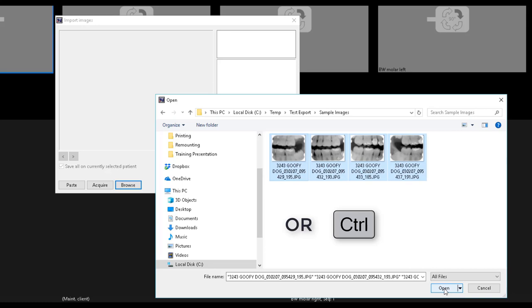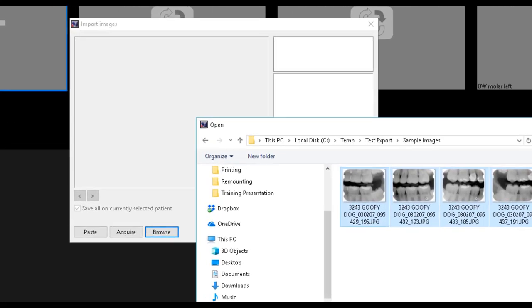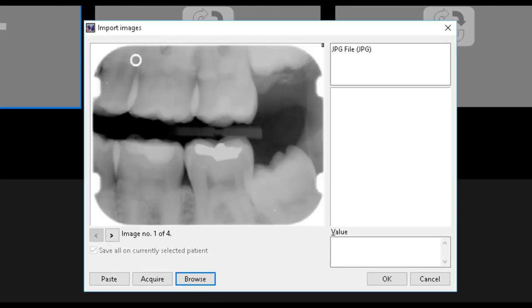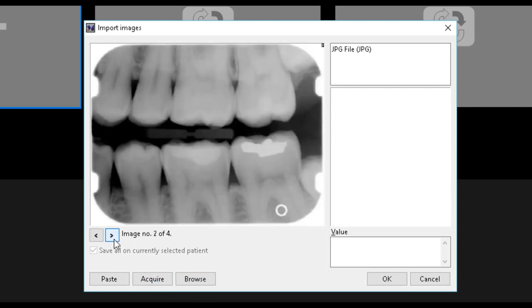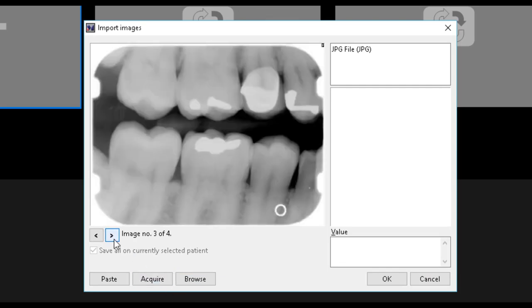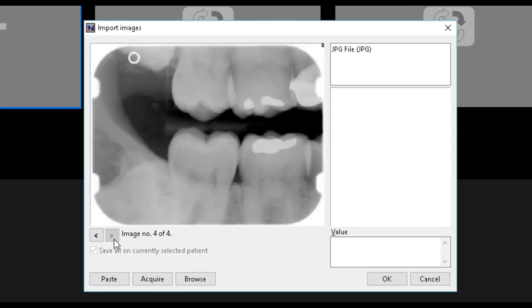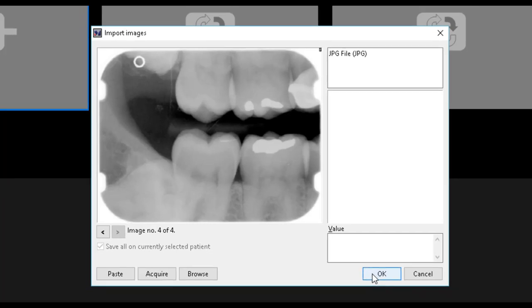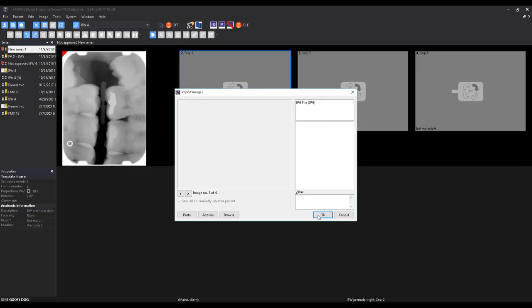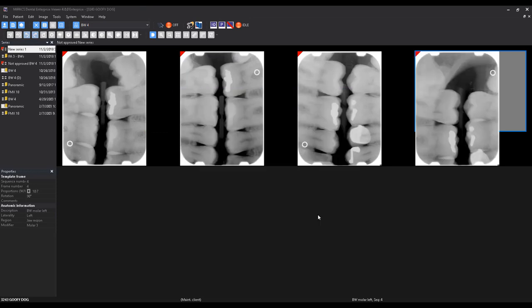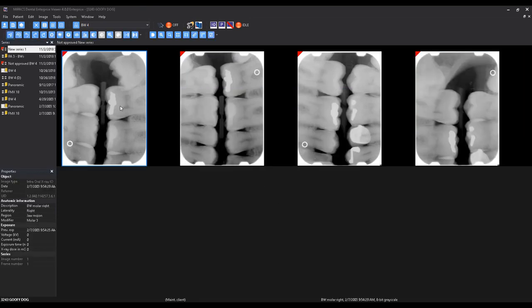You can use Control A to select all the images in a particular folder or Control to select multiple images. After the images have been selected, click the Open button. Here you can scroll through each of the images to ensure your selection is accurate. Select the OK button to finalize the import. After the images have entered the MyPax viewer, it may be necessary to rotate them to the proper orientation.